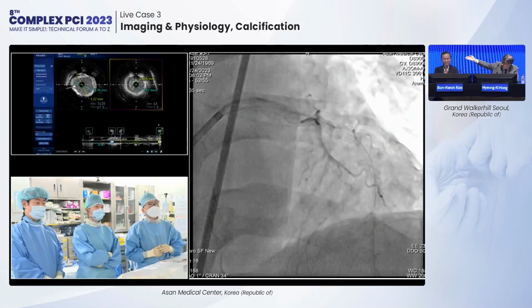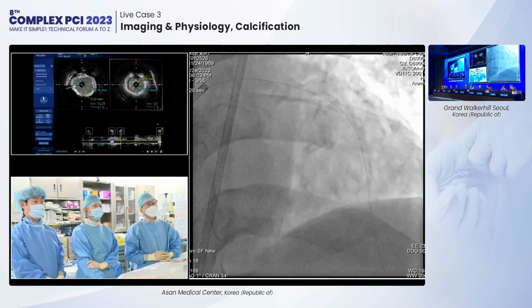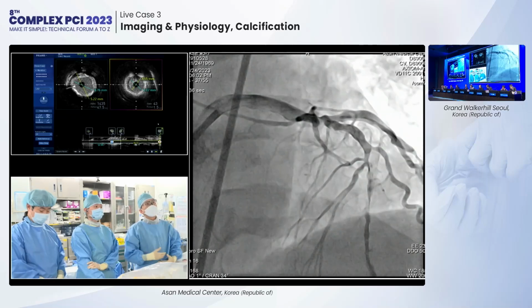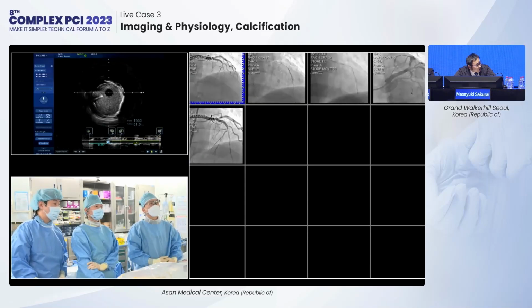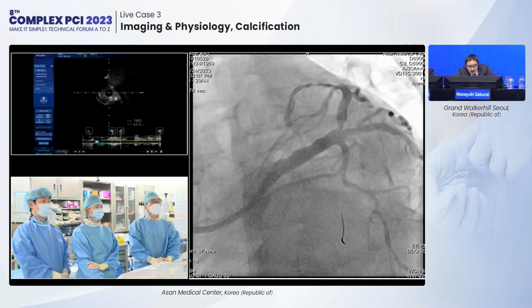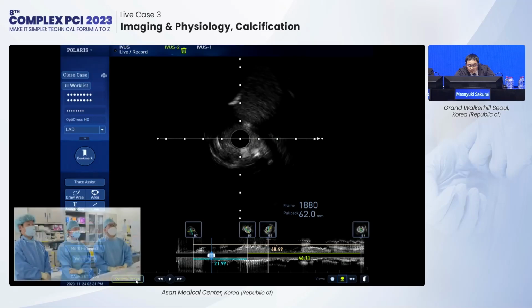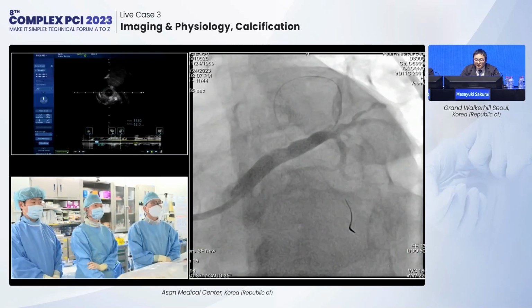Any comment? Okay, go ahead. I was finding already at the ostium there is severe ostium calcification, so I would choose rotablation. What size of burr? What size guiding catheter? 7 French? The guiding catheter is 7 French. I would like a 2.0 burr. 2.0, yeah. Wow, a bigger, very large burr. Dr. Murasato?